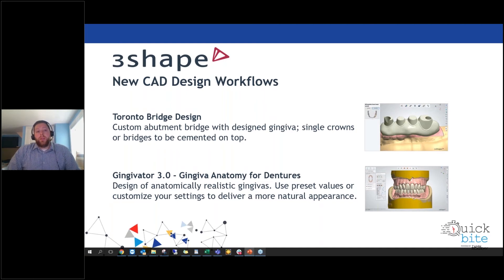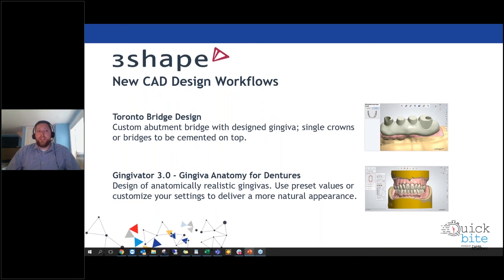Another great new feature in 2020 is Gingivator 3.0 — the Gingiva Anatomy design for dentures. Designing gingiva is probably one of the hardest and most time-consuming aspects of the digital denture process, typically requiring 10 to 15 minutes. With the new Gingivator, the anatomy design is very realistic, faster, and simpler. You can use preset values or customize your settings to deliver a more natural appearance and create more accurate digital dentures.